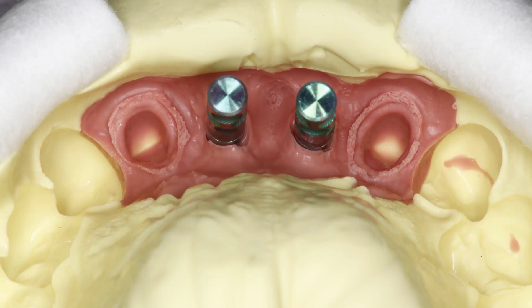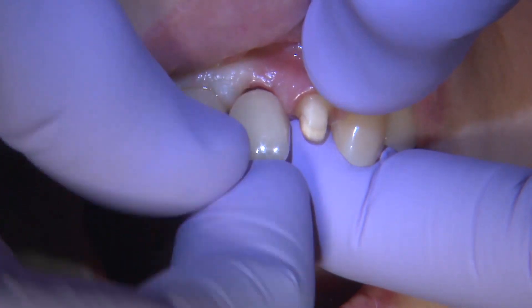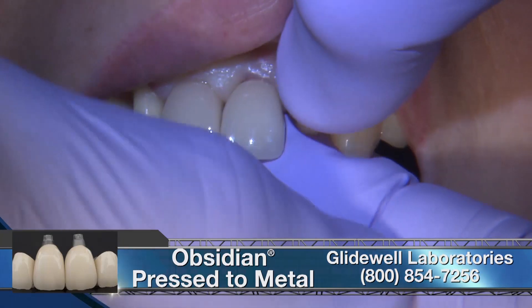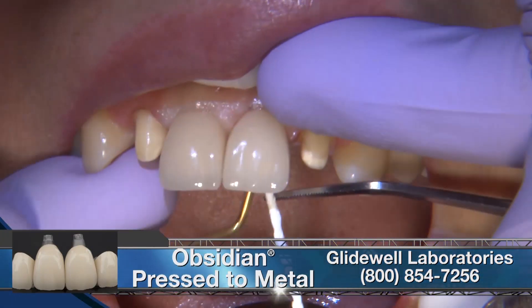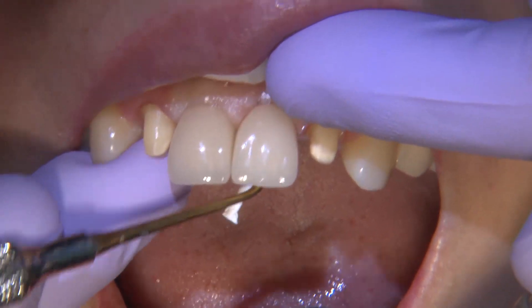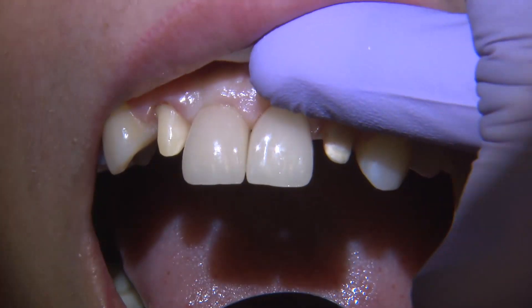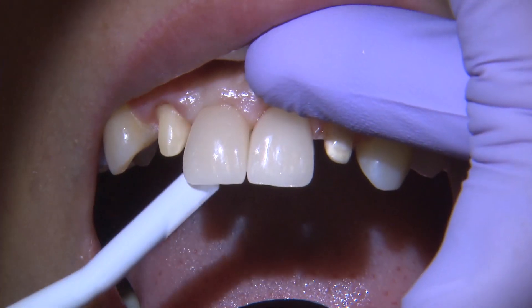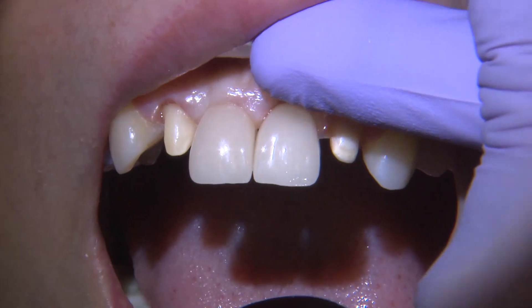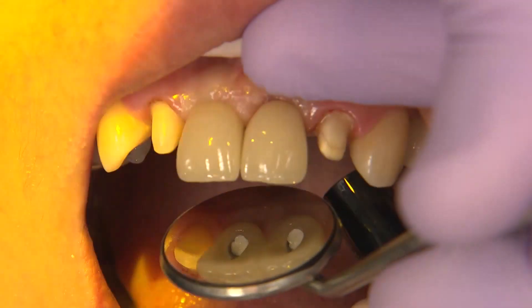One restoration type I've found highly effective when a patient or clinician prefers a porcelain-fused-to-metal restoration is obsidian-to-metal, which has been extremely aesthetic and very acceptable in terms of final results. In this case, I prescribed obsidian-to-metal restorations for both the implant restorations and the laterals on natural teeth.